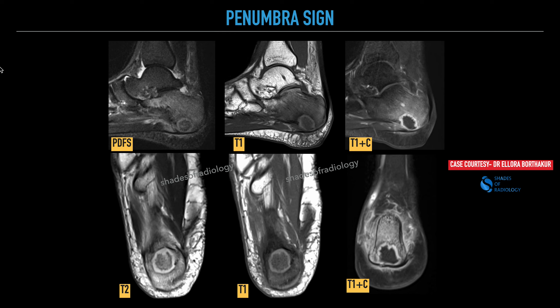These are the various sequences which were obtained — the PD-FATSAT sequence. You can see a well-defined lesion which is very obvious. On T1 you can see the lesion showing central T1 hypointensity with a hyperintense rim and again a hypointense rim, with extensive edema which is hypointense on T1 weighted sequence.